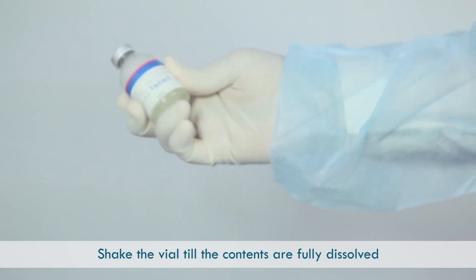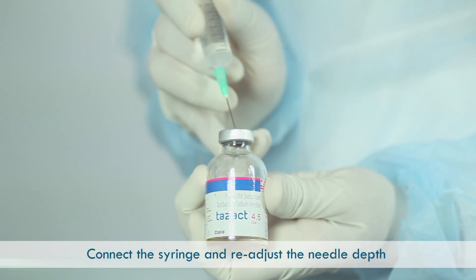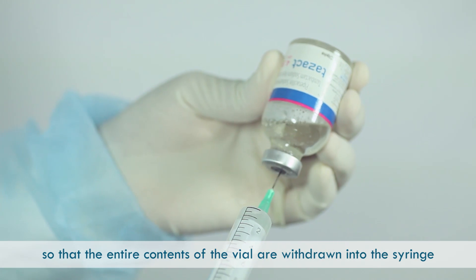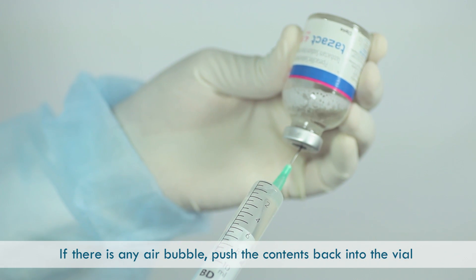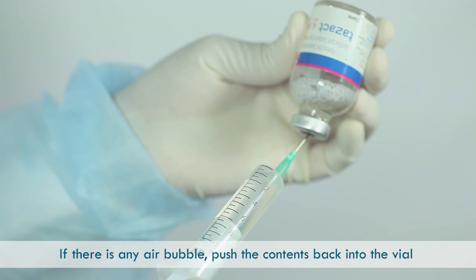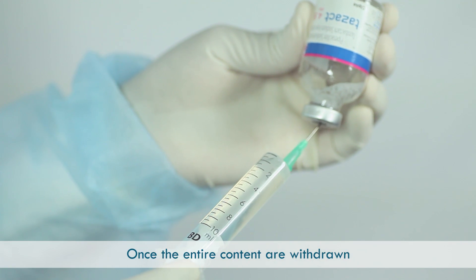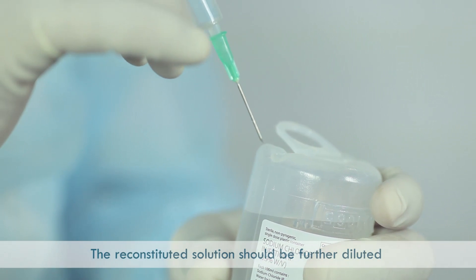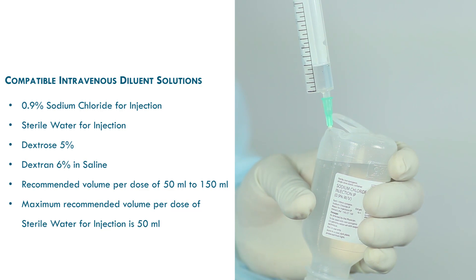Shake the vial until the contents are fully dissolved. Connect the syringe and readjust the needle depth so that the entire contents of the vial are withdrawn into the syringe. If there are any air bubbles, push the contents back into the vial and withdraw again. Once the entire contents are withdrawn, disconnect the syringe along with the needle from the vial. The reconstituted solution should be further diluted with a compatible intravenous solution.